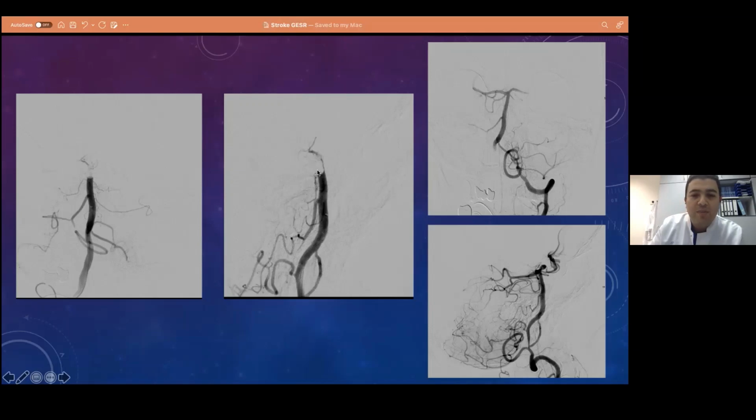So I passed it and I did one maneuver, and I was lucky. It was really one maneuver on the right side with a Terumo wire inside the vertebral artery and the micro guide wire and stent retriever afterwards to get it recanalized, and it was recanalized, but the right vertebral artery is still not good, but I didn't do it. And I did my control from the left side to see that open back again.